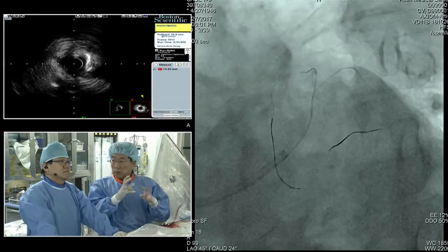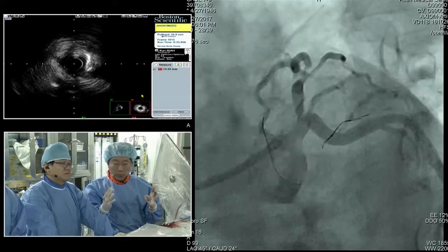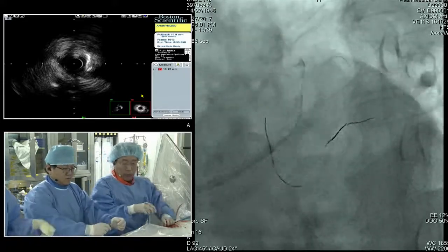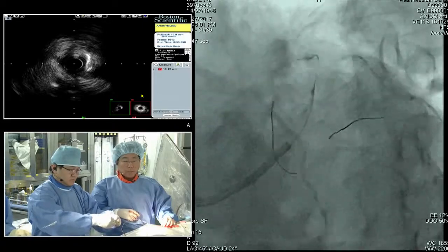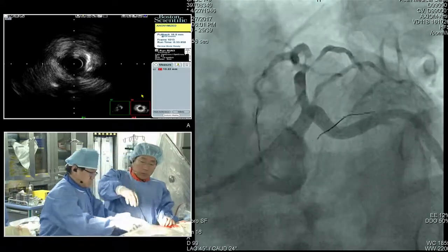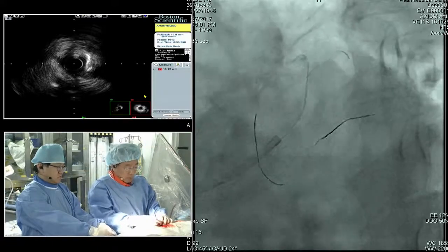So, all right, we've learned, anyway, there is critical stenosis of the diagonal ostial part. There's some superficial calcium too, size-wise almost 2.75 to 3.0. And so we're going to do a 2.5 non-compliant balloon inflation for the diagonal branch. And we're going to deploy the 2.75. What about the lesion length? Could you measure that? Show this, the diagonal branch.